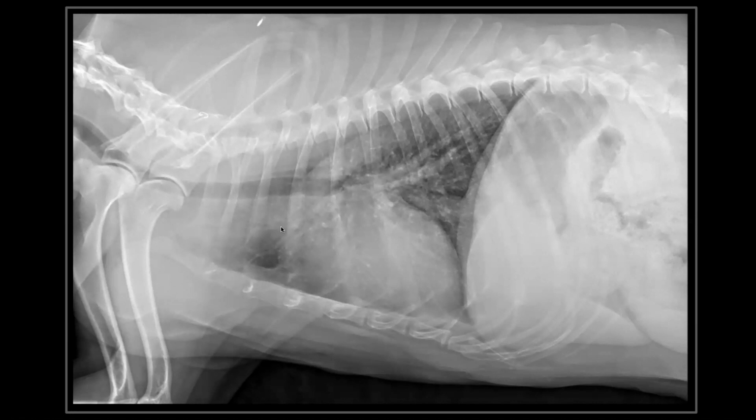Here you can actually see them tapering nicely. Again, you don't. They really are smoky. They're not distinct. This dog actually has some mineralizations in its lungs, but this would also be a positive for bronchointerstitial infiltrate.